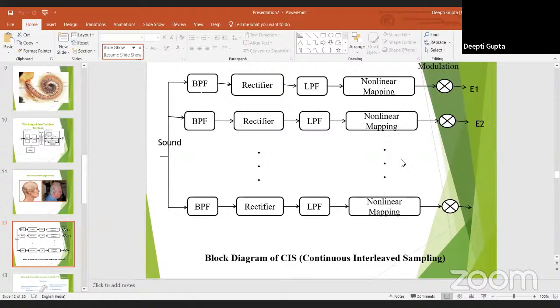After cochlear implantation, training and speech therapies are required so that a person is able to understand the meaning of the voice that is coming through the cochlear implant. After speech therapy and all these things, the user becomes used to it and is able to understand the meaning of that electronic sound. After that, the user is able to hear.